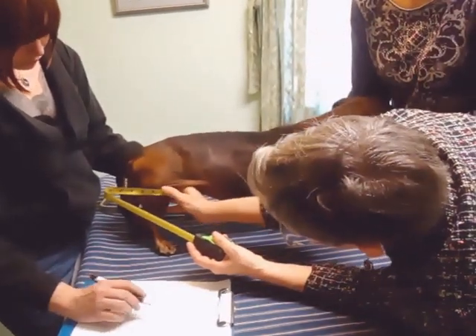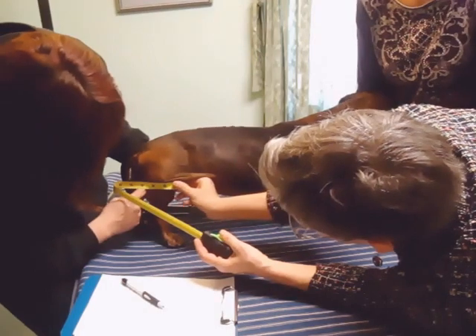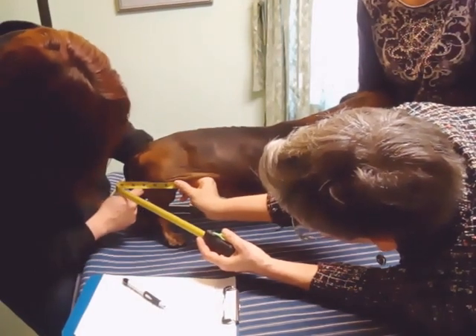For C, you measure the widest part of the drumstick from the inguinal fold to the ischium, and we're getting three and three-quarters.